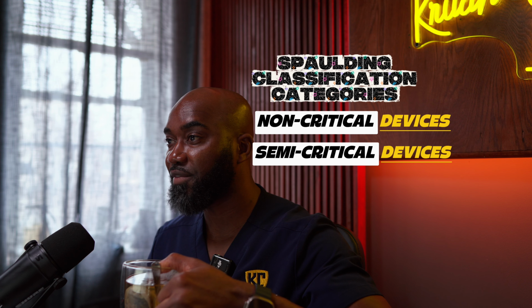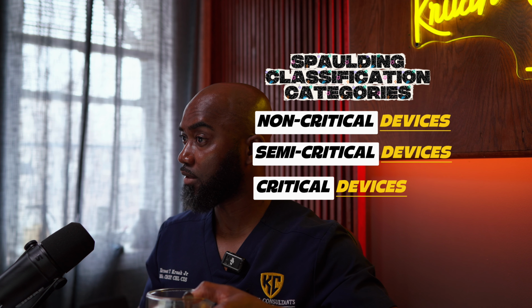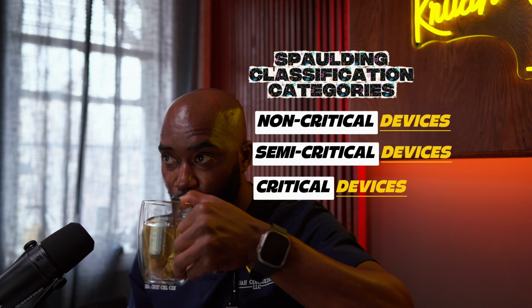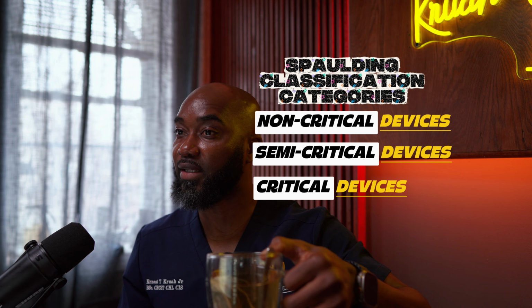Under the Spaulding classification, we categorize medical instrumentation into 3 categories. And what are those categories? Critical, semi-critical, and non-critical. Esperanza, give us the 3 categories.